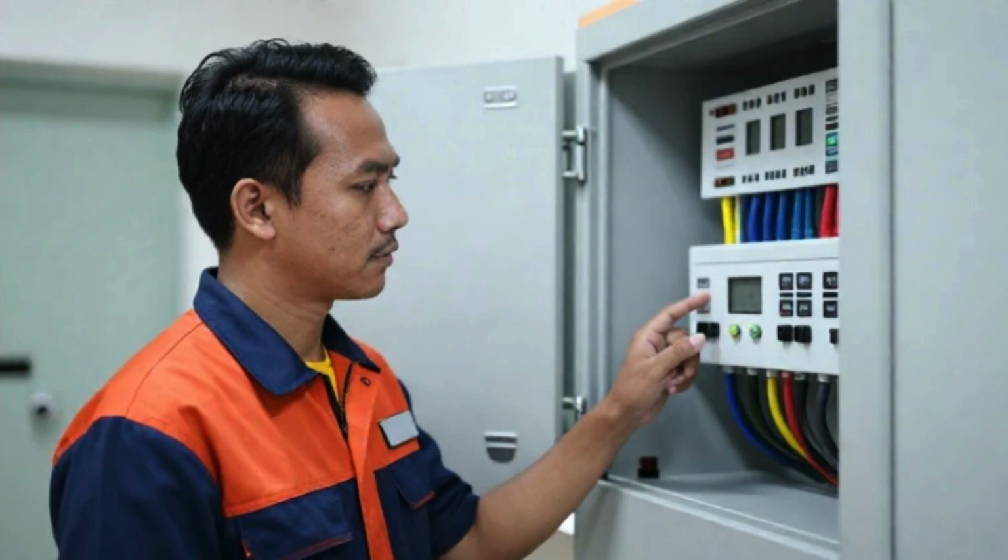4. What is leakage current? A. Current intentionally delivered to patients. B. A large electrical discharge during a fault. C. Unintended small electrical current flowing from equipment. D. Current stored inside batteries. 5. Why is leakage current dangerous in medical settings? A. It increases power consumption. B. It may affect vulnerable or invasively connected patients. C. It shortens equipment lifespan. D. It damages hospital walls.